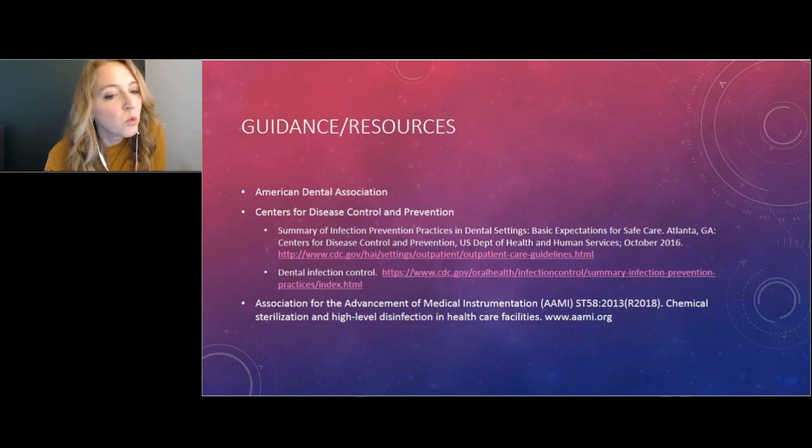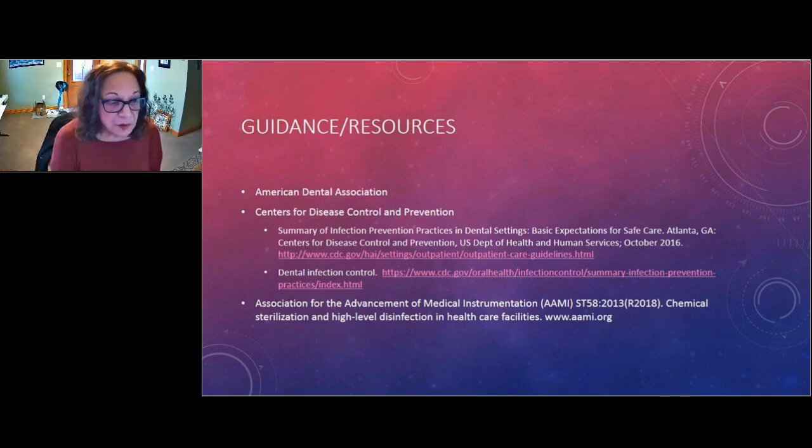The first question is, what are the typical concentrations of sodium hypochlorite for dental sterilization of instruments? Sodium hypochlorite, I have not seen any chemicals approved by the FDA for cold chemical or high-level disinfection of instrumentation.